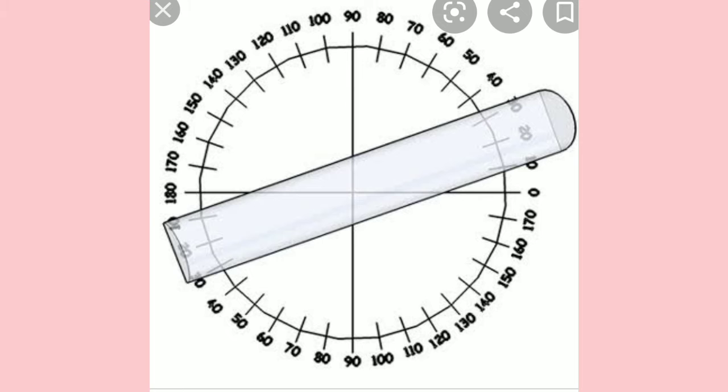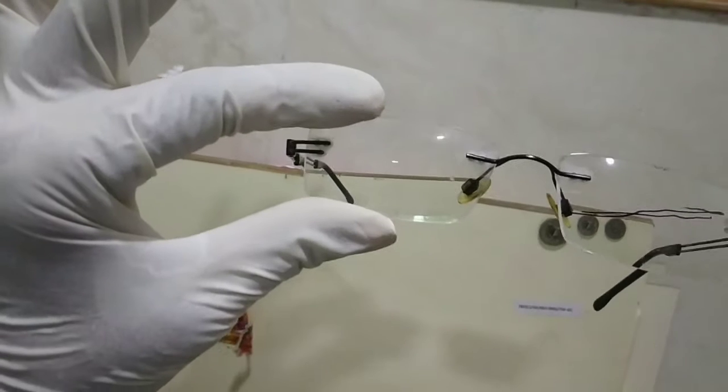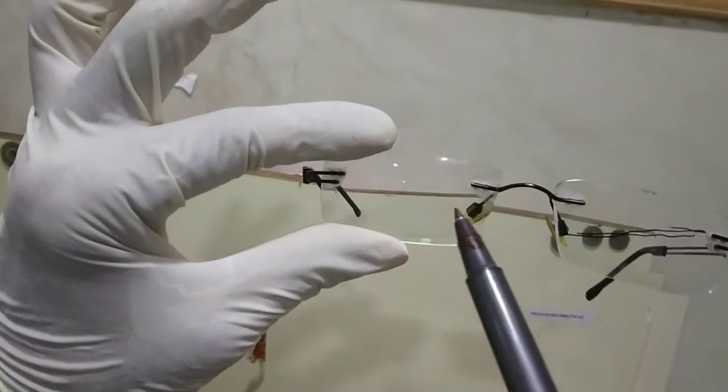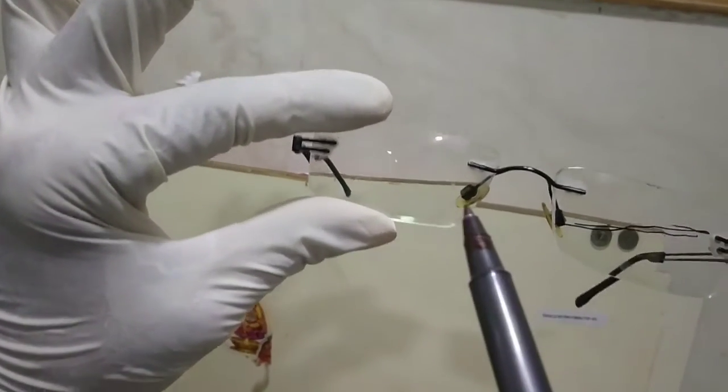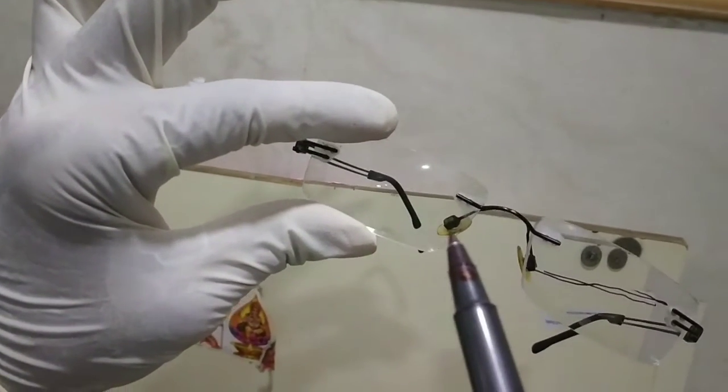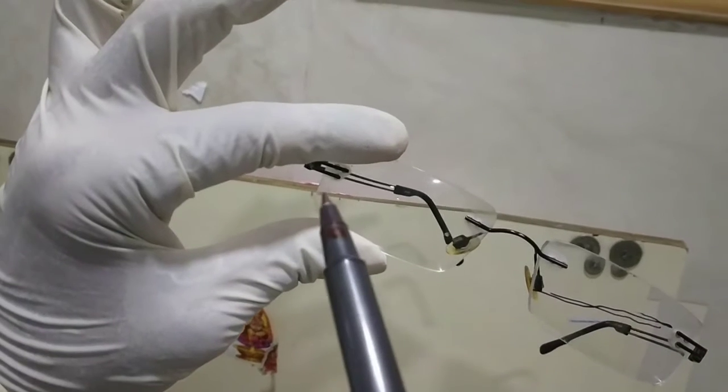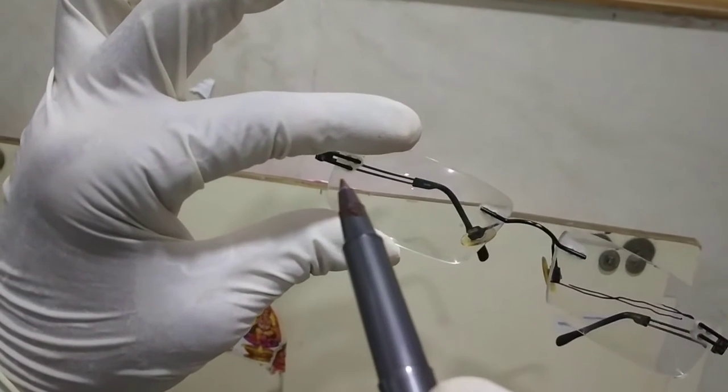Hello friends, today we will learn about manual axis marking. First thing, you have to see the line which is behind the lens. You have to align it straight by keeping the lens like that.